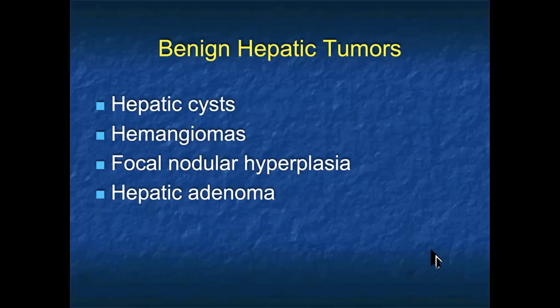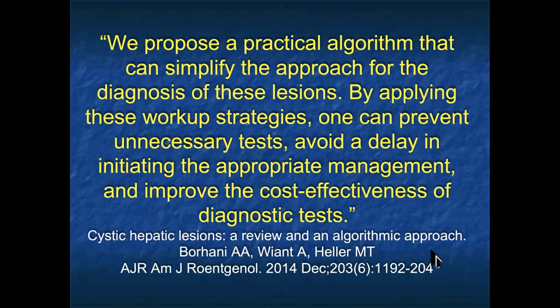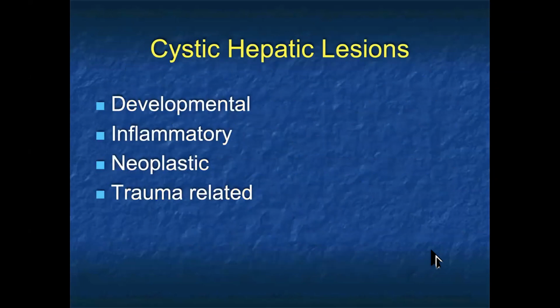And that becomes very, very important. People have talked about different strategies. The importance of being able to be specific is that you don't keep adding on additional studies. If you simply read your scans as the patient has a lesion, here's a differential diagnosis, then you end up with either an anxious patient, an anxious referring physician, or more and more studies.